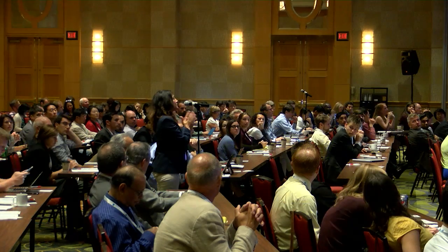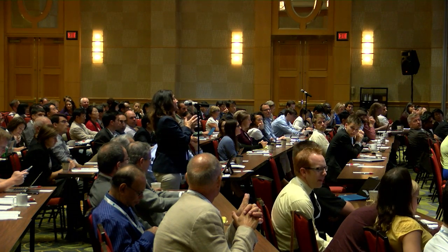Would you expect that gadolinium would interfere with temperature mapping? Yes, the released gadolinium? Well, we do to a certain extent. The amount of gadolinium that we have when we do not release the gadolinium from the liposomes is small, and if you calculate it, it should lead to maybe a temperature change of about 0.5 degree Celsius. But once it releases, what changes is that there actually might be some accumulation of the gadolinium, and there you might have a temperature change in your temperature map, which you should correct for.